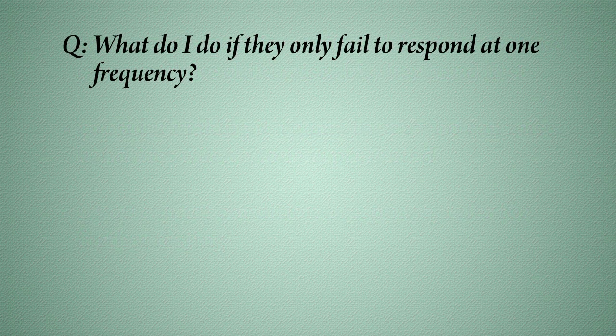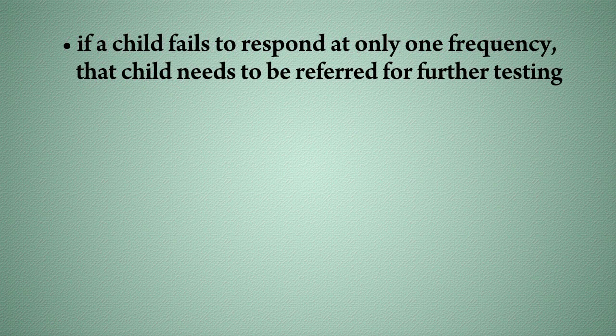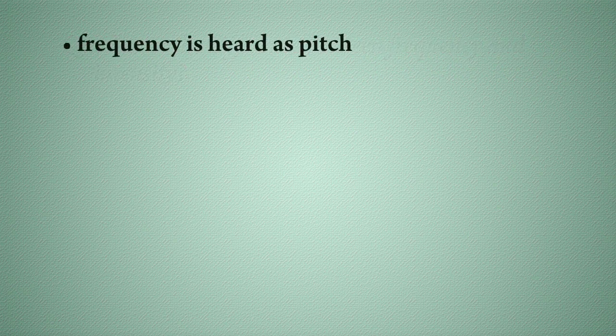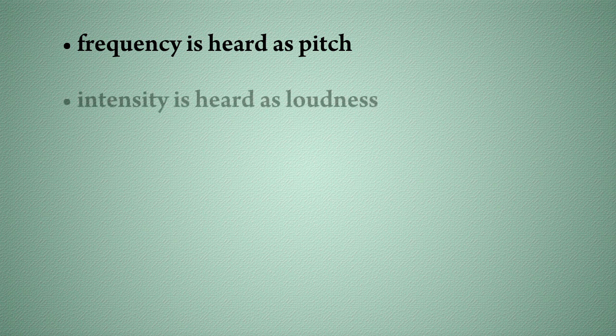What do I do if they only fail to respond at one frequency? If a child fails to respond at only one frequency, that child needs to be referred for further testing. What is the difference between frequency and intensity? Frequency is heard as pitch, like do, re, mi, fa, sol, la, ti, do, and intensity is heard as loudness, such as whisper, talking, shouting.